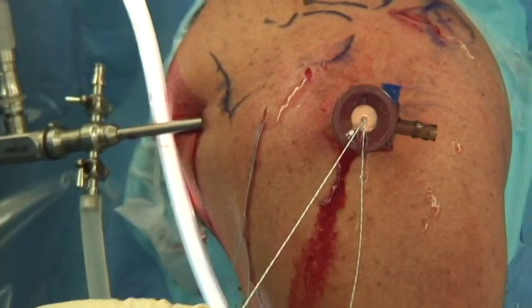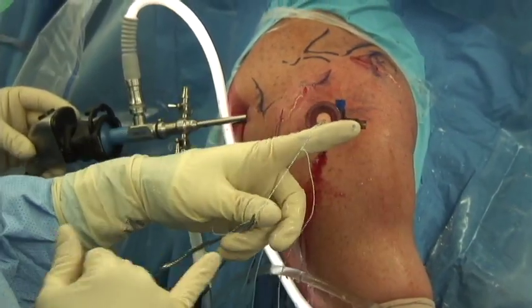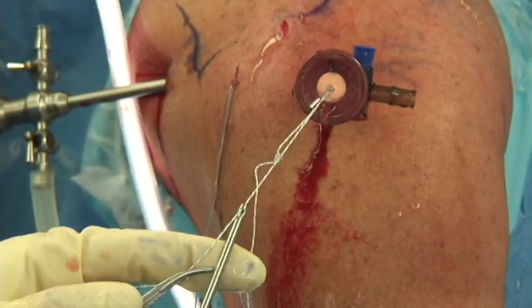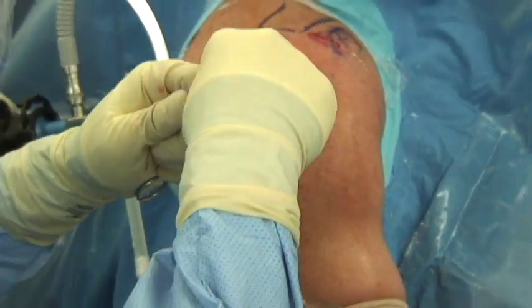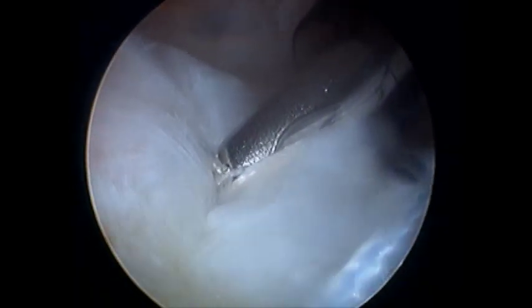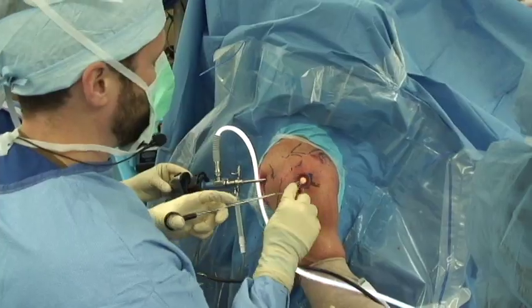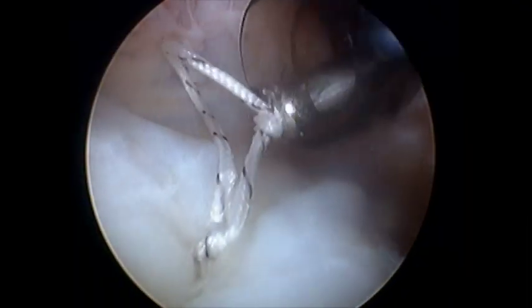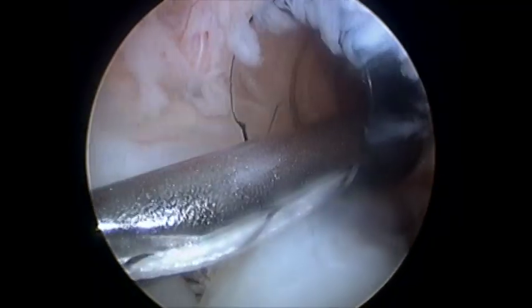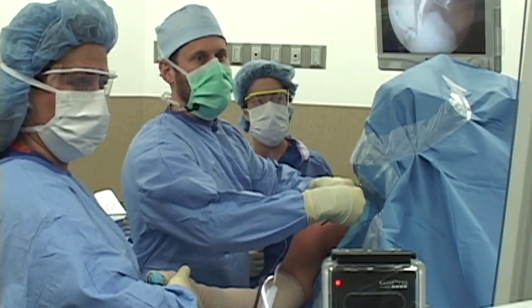Now we'll tie a knot outside the body. I've got the two sutures and I'm going to tie a knot here. We'll use this knot pusher to slide that onto the tendon. And now I've got a knot outside the body — push it down onto the tendon. You can see it going down onto the tendon and pushing it down to the bone. Now we'll tighten that knot up, lock it, and add an additional half knot for security. I will cut one of these two stitches but save the other one. We'll take the one we did not cut and park it in the front of the shoulder.